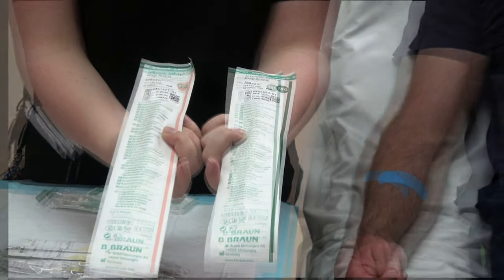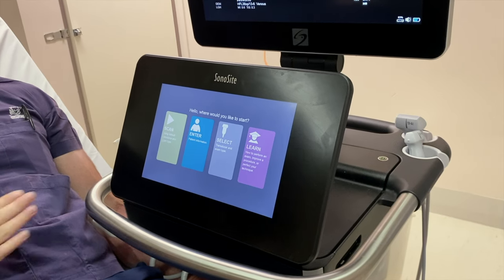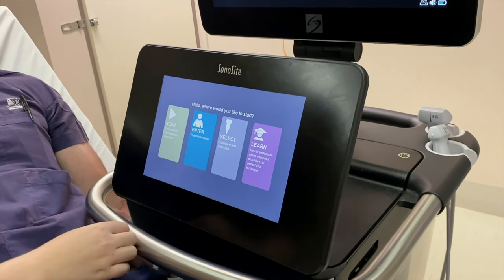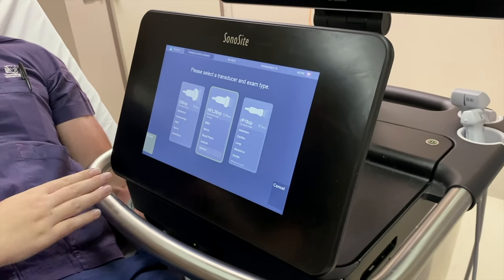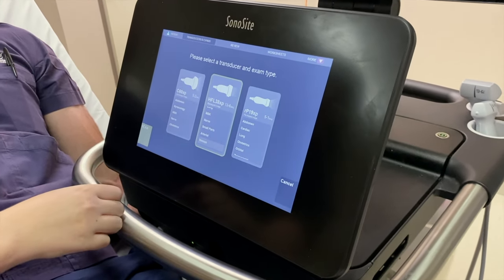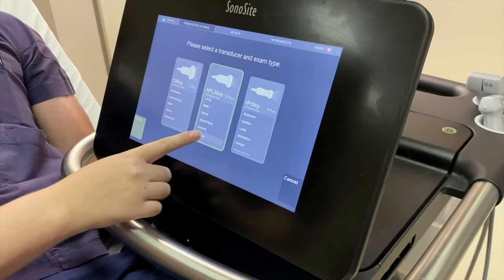Now let's see how to set up the software on the machine. There are a number of functions available on this screen. The one that we are after is this one here. We then want to pick the linear probe, and from here you can scroll through and pick venous.